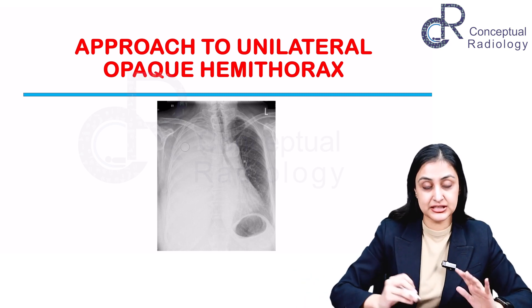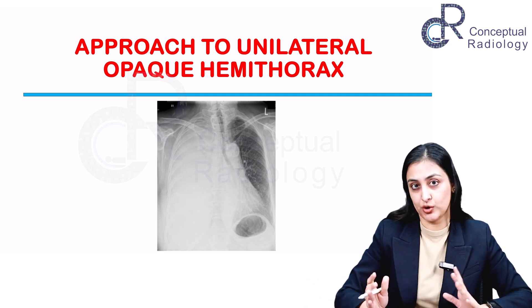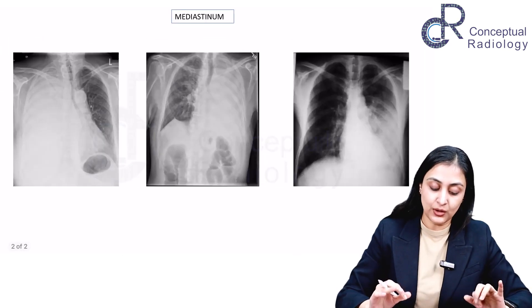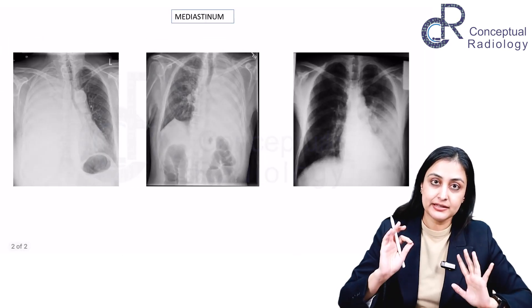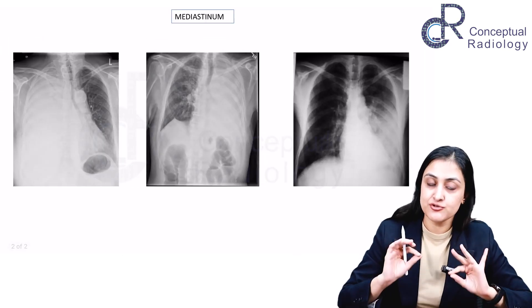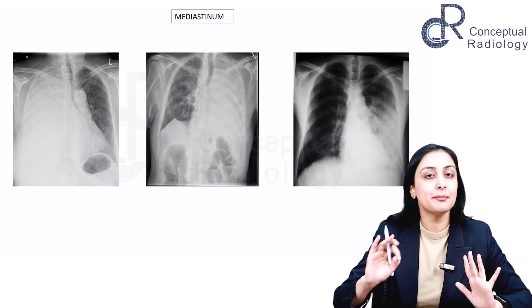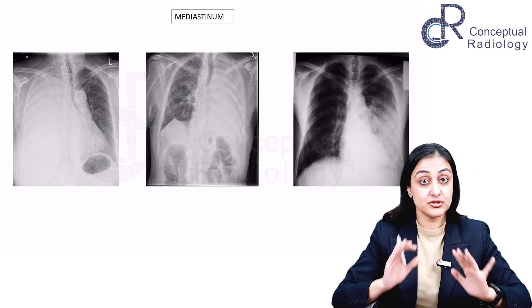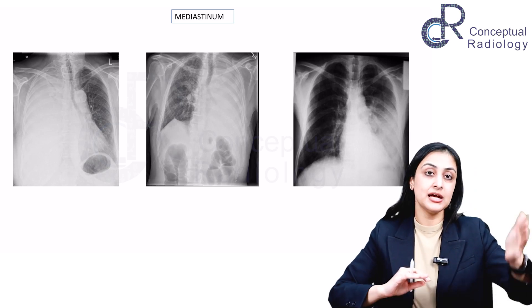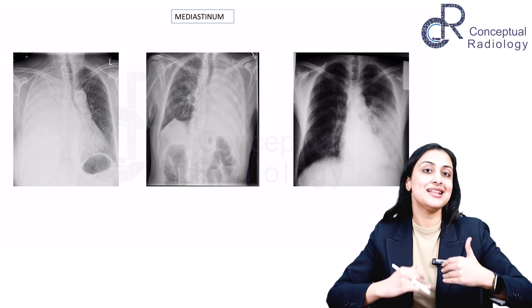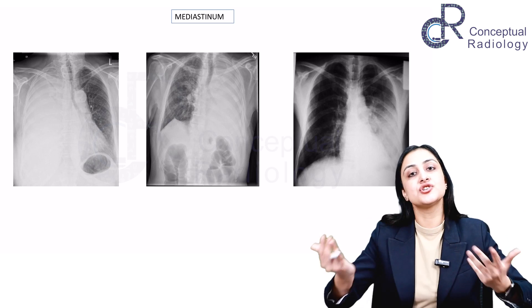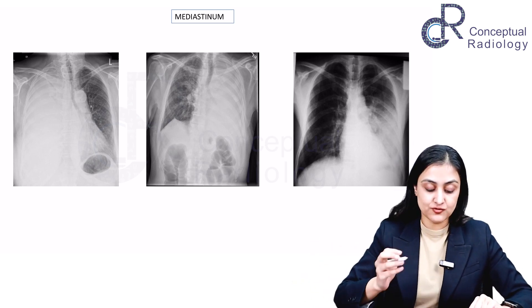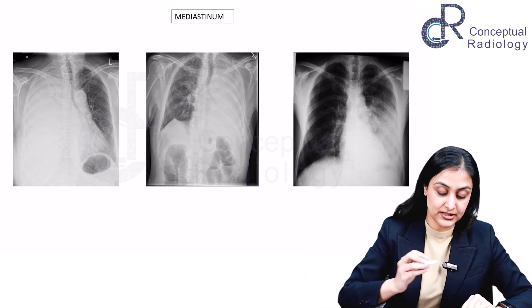This is a case where one side of the chest appears much more opaque than the other, and there is no controversy as to which side is abnormal — it is obviously the opaque one. The only thing you have to look at here is the mediastinum: whether it is shifted, and if so, is it an ipsilateral or contralateral shift? That is all we have to assess.